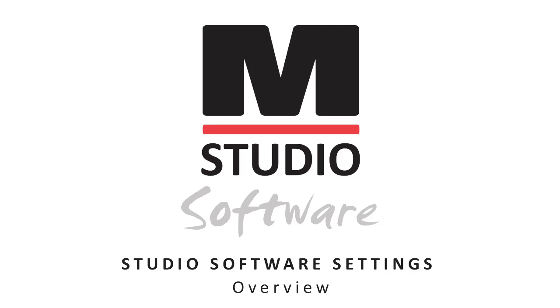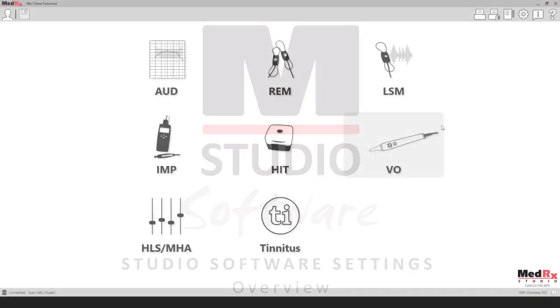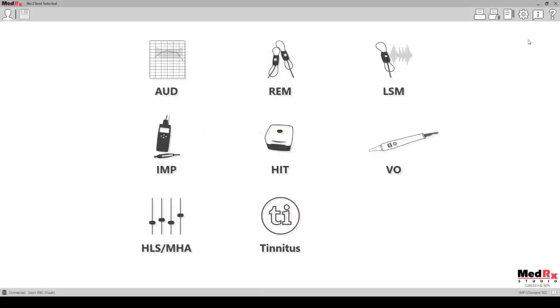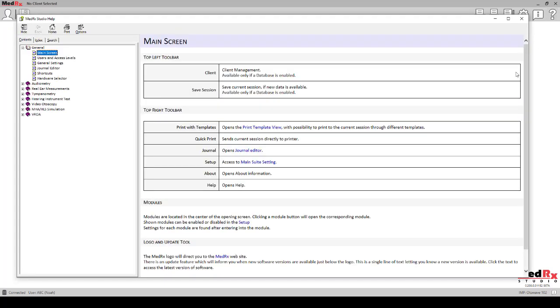The purpose of this tutorial is to get you up and running with your MedRx Studio software. Please consult the interactive help system within the Studio software for more detailed information and features and functionality.